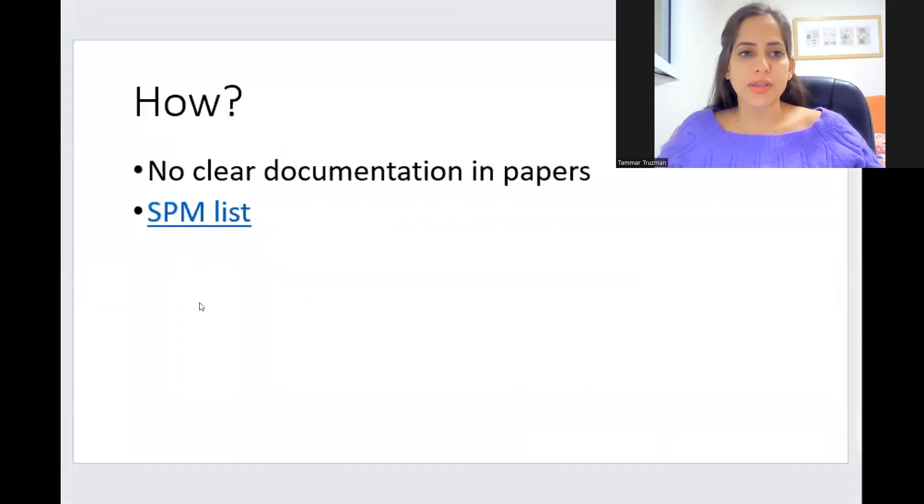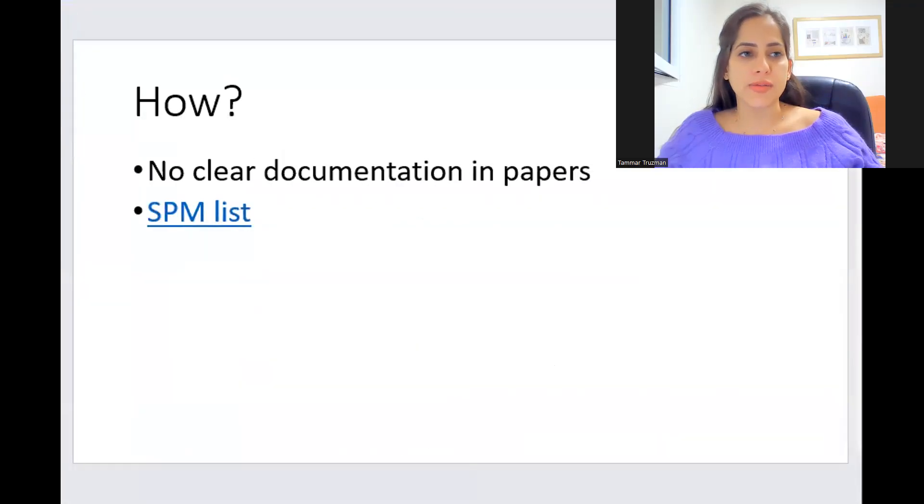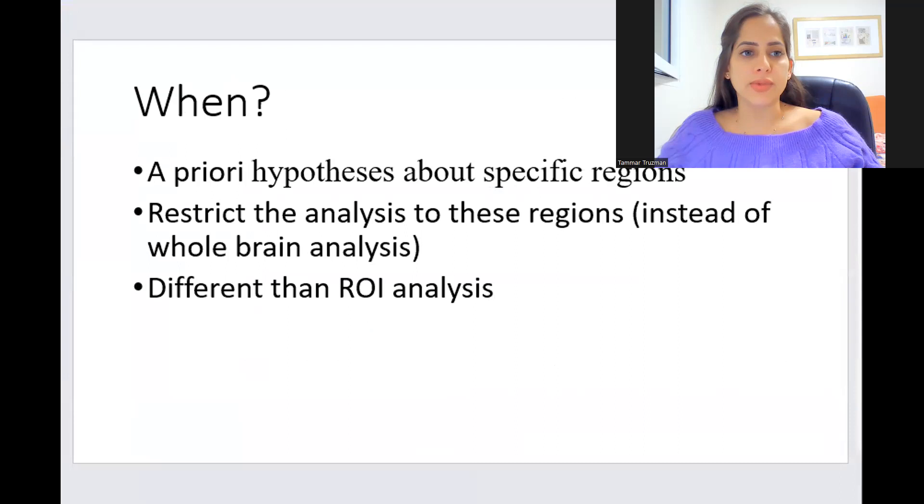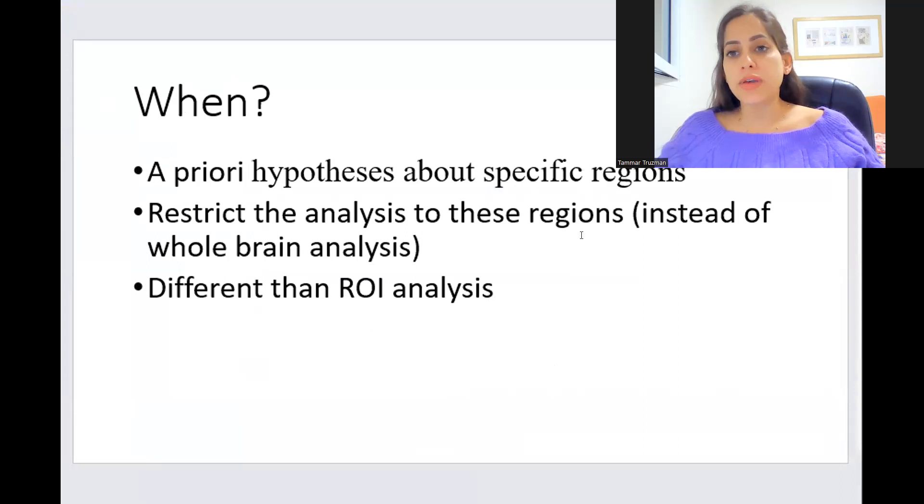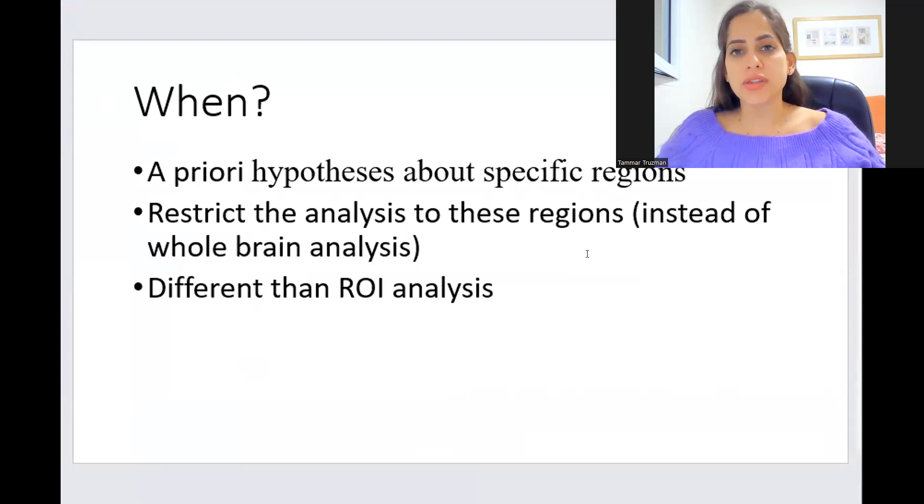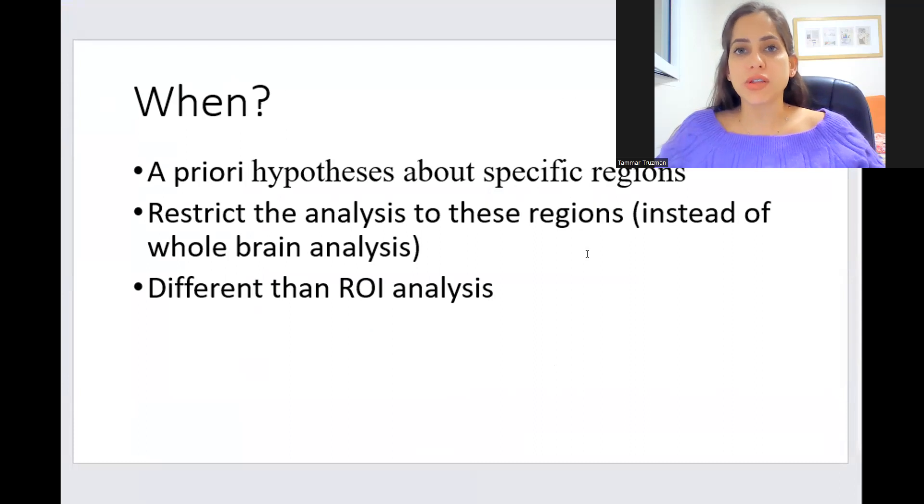So first of all, when using small volume correction, it's when you have a strong a priori hypothesis about specific regions in your study.